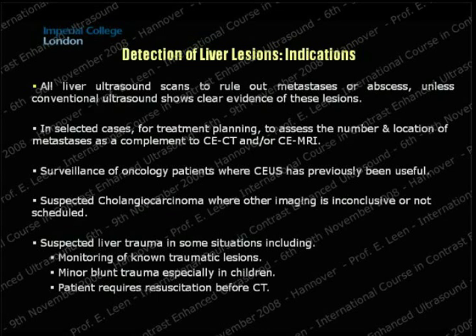So I think it's fairly legitimate to actually use contrast in this kind of circumstance. The next one is interesting in the sense that, in children, although none of the agents is actually licensed for use in pediatric care, one will have to request local ethics acceptance in using contrast in children in the first place. But I think it would be wise, given that you don't want any radiation in children, using CEUS would be appropriate with the help of your ethics committee.